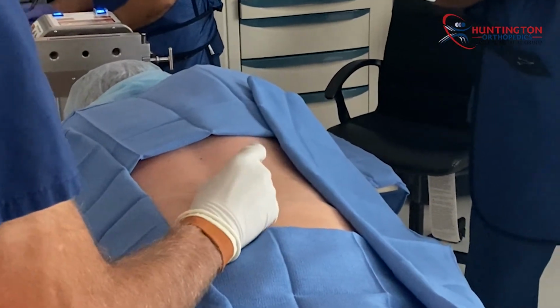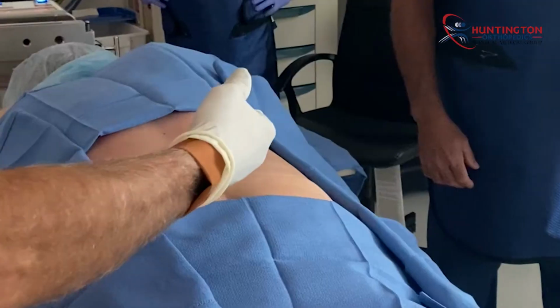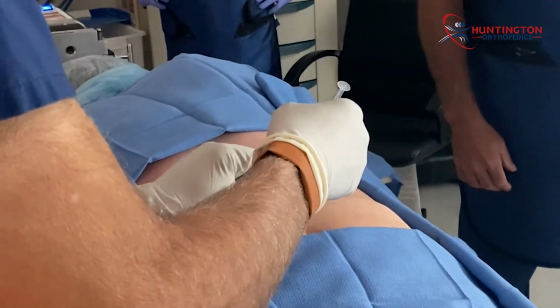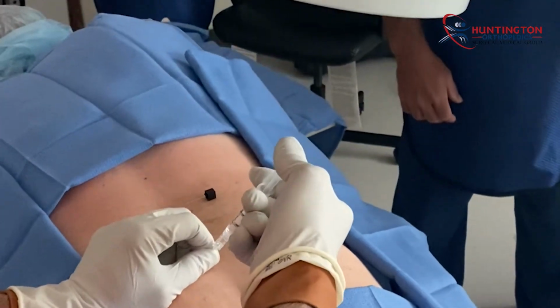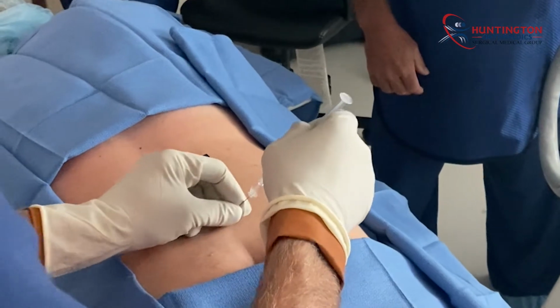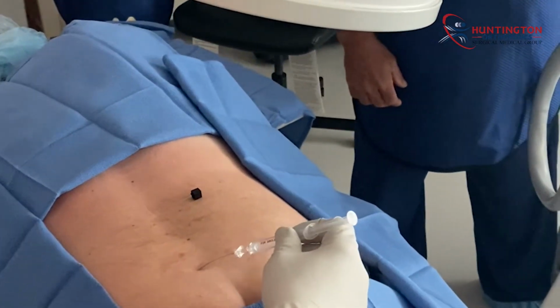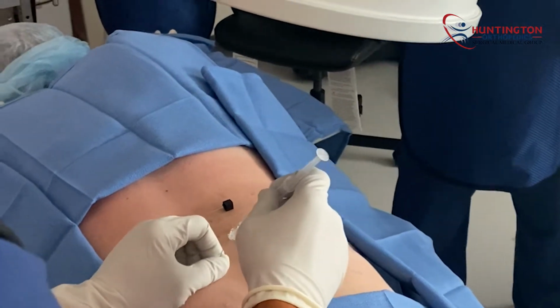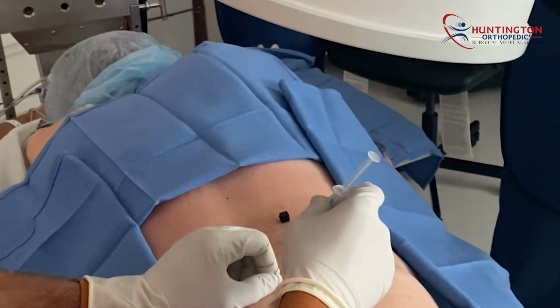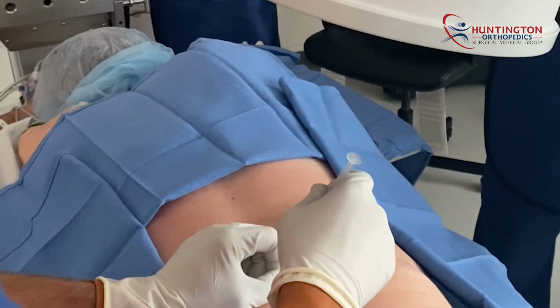short-acting and long-acting steroids, and for most people it helps to use a long-acting steroid. It's a short procedure and tends to be pretty well tolerated and can be really helpful. It may not get the patient where they want to be, but it can give them a little relief and let them know that maybe it's going to be persistent if they do need a small procedure like a microdiscectomy.